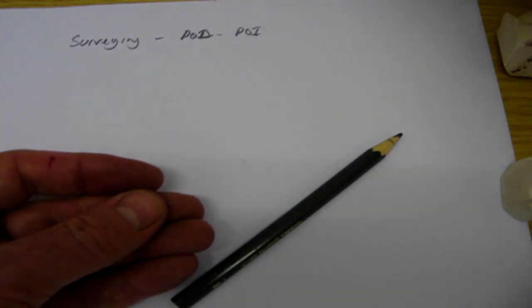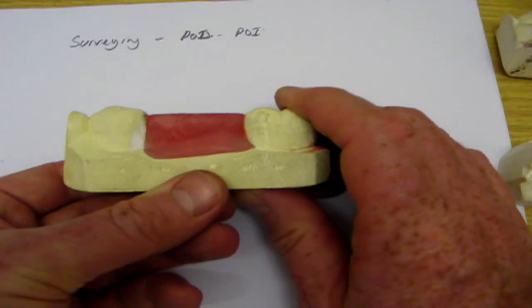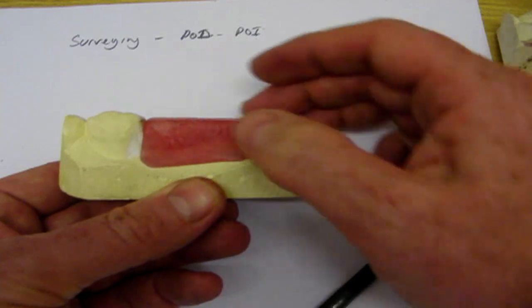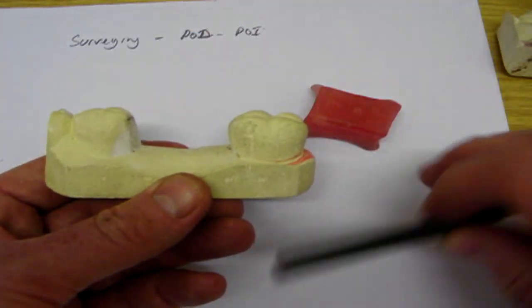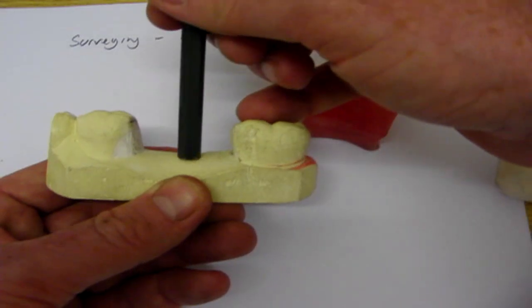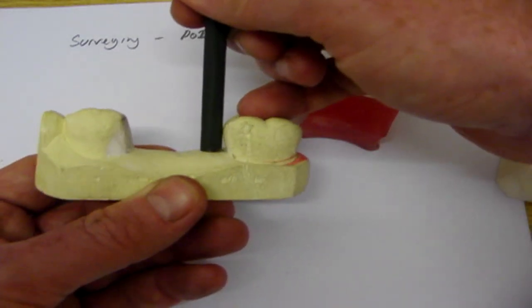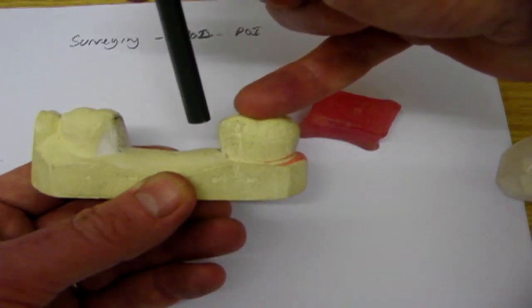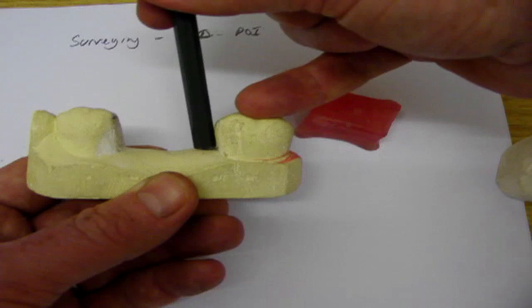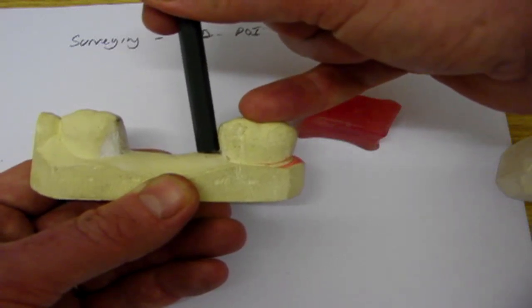Now we can do a third option, a second workable option. In this case, what we've done is surveyed the model relative to the path of displacement and found the undercut, the same undercut as on the previous model, but we've decided to create a path of insertion such that the denture slots down the mesial aspect of the molar and engages the undercut.